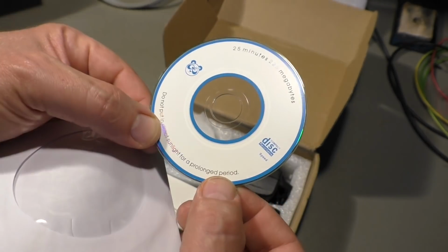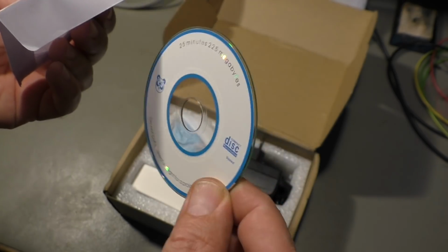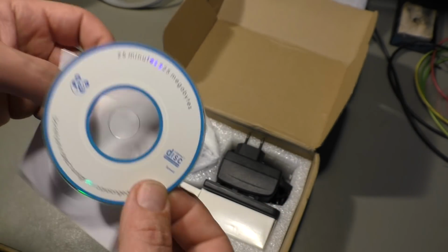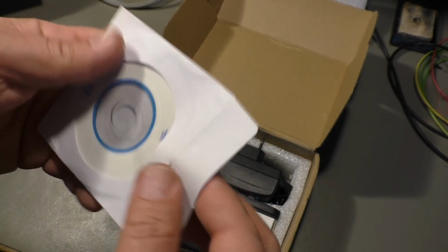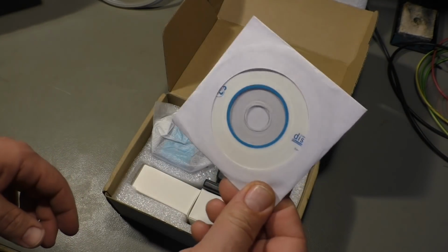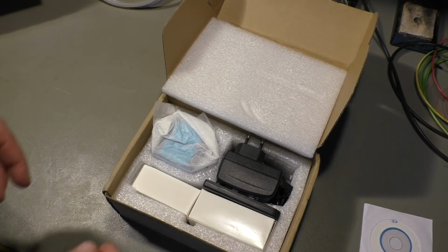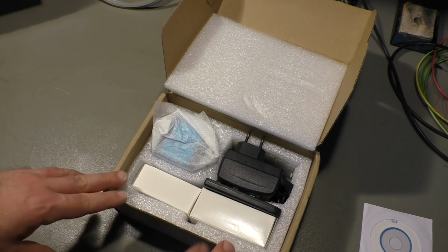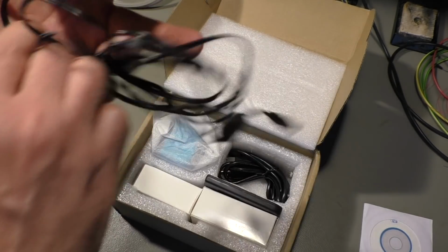a CD-ROM, which I will not put in my computer. Firstly, because I don't have a CD-ROM drive right now, and who knows what's on this. Maybe the user manual can be found online, isn't worth downloading because, well, it's not the best user manual you can find. Then we have a power supply.